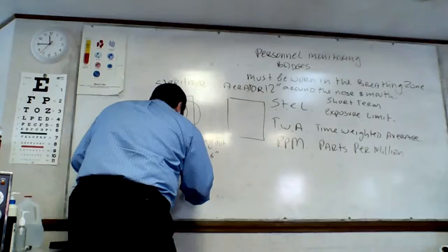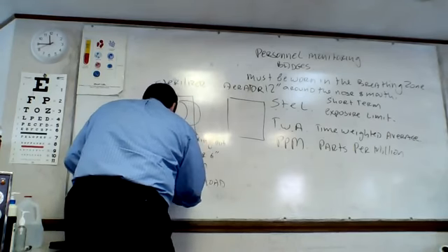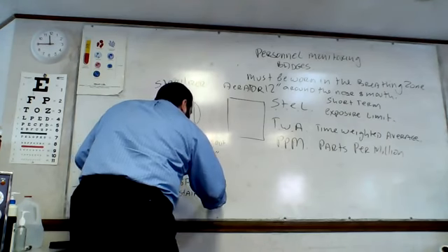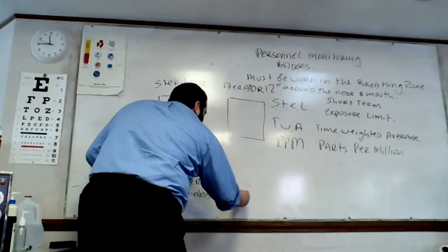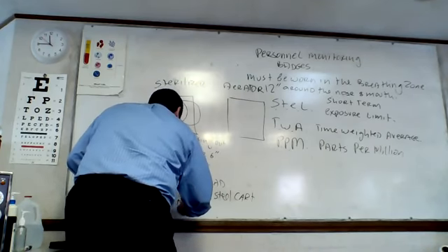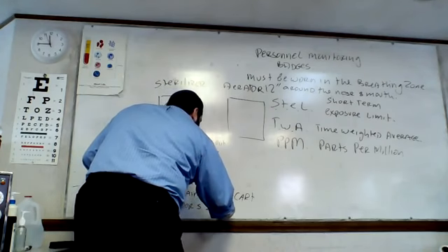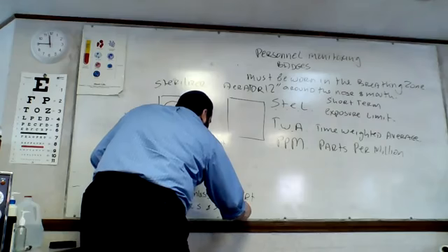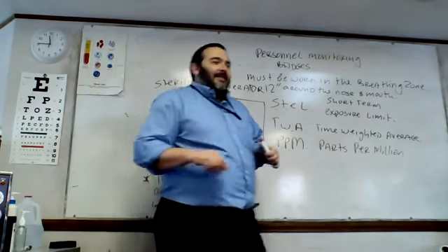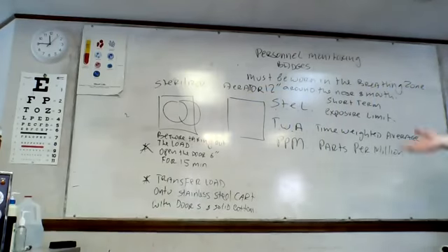Transfer load onto stainless steel cart with doors and solid bottom. See what I do for you? I even had to write that down.